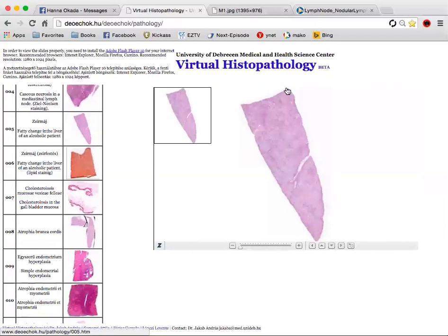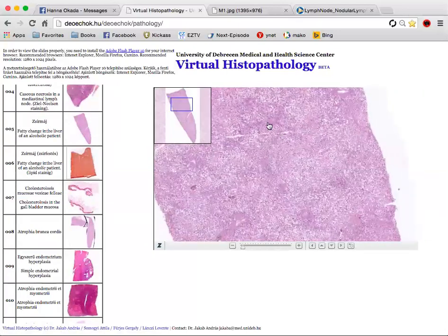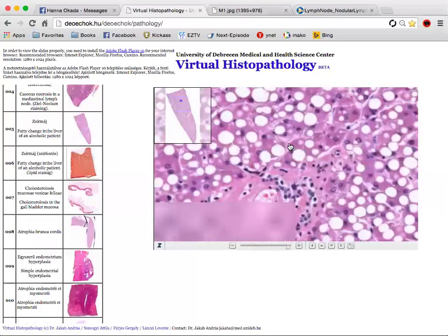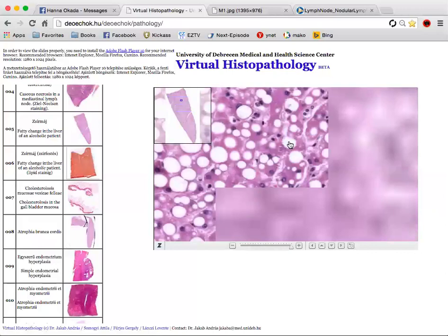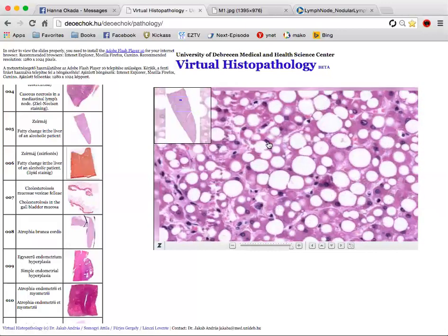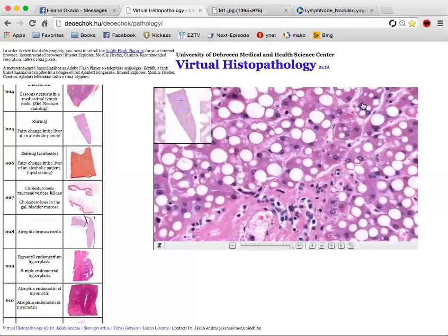And so this whole specimen is pathological. Okay, so you're not going to see any normal hepatic tissue here. I'm going to show you this. And what's really important to understand here is that these are all hepatocytes. These are not adipocytes. These are all liver cells.